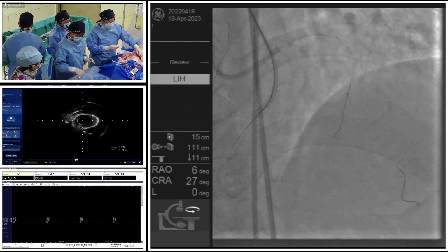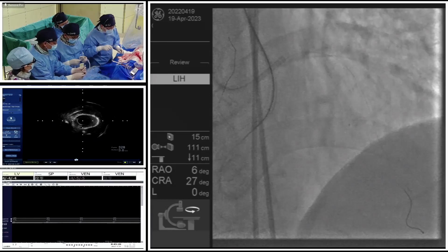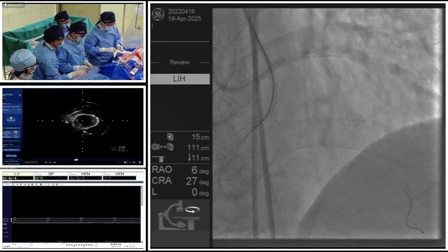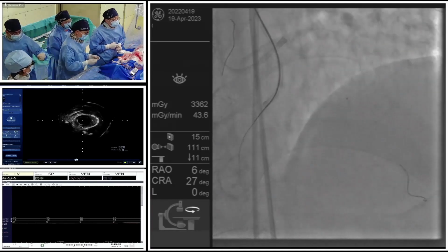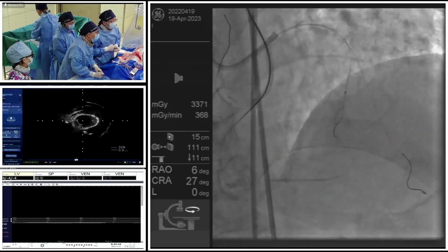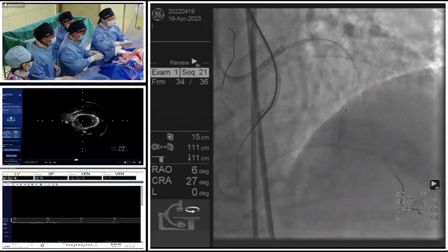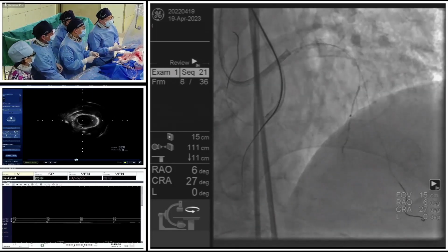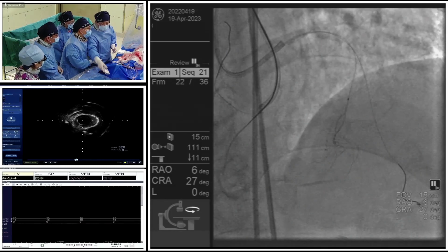Okay, so sometimes we could try septal wire surfing, and as has been reported for septal wire surfing, the success rate is about 81%. But before the surfing, I like to do a contrast injection. You can see Professor Li is performing contrast guided. We're using the Corsair to make a high selective angiography from the collateral flow pathway, the CC level, and also the tortuosity, which helps us to make the surfing.